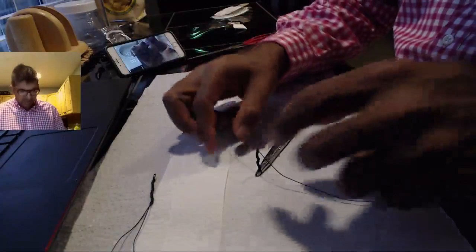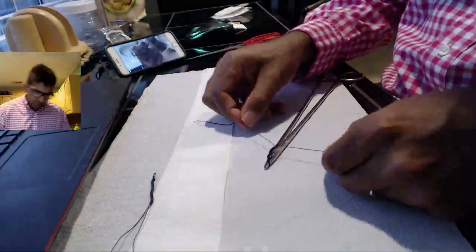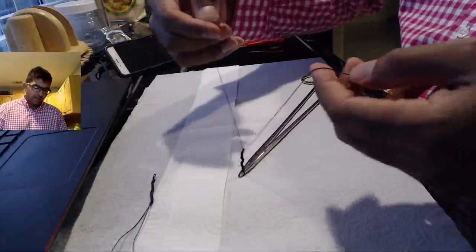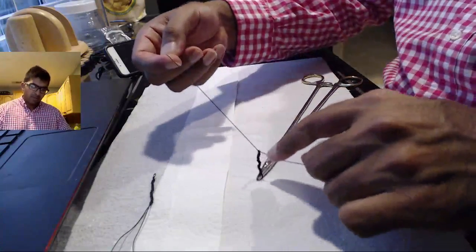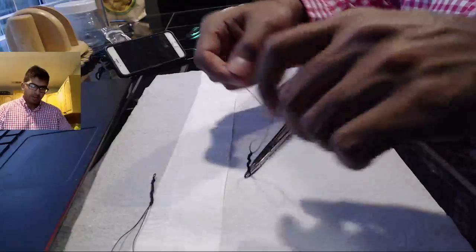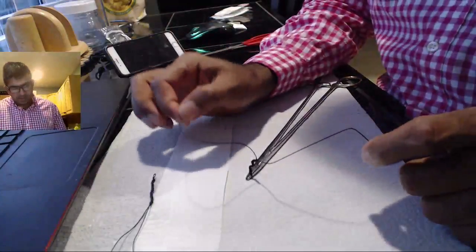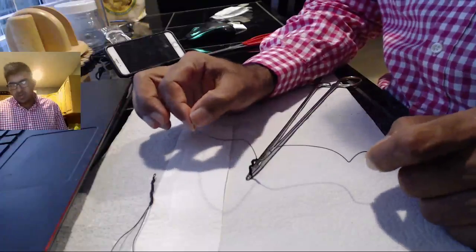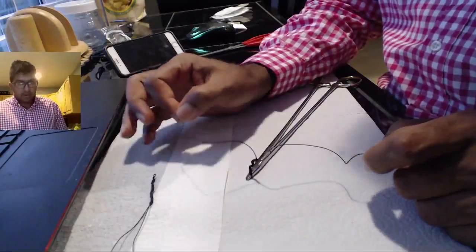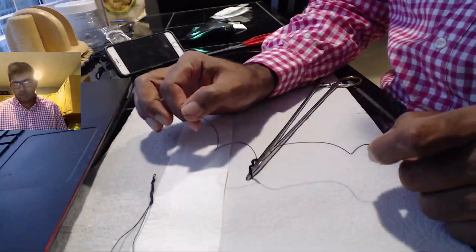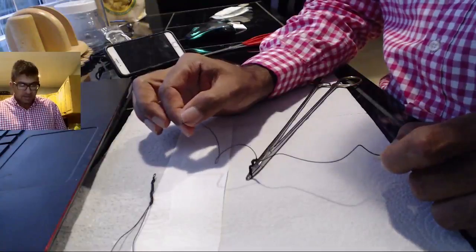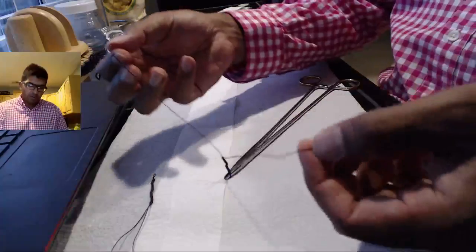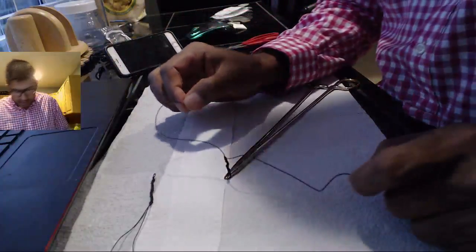So 16 knots in one minute. If you look at the knots, they're very uniform. I alternated from forehand to backhand. And the more important thing is that I brought every knot down and set it down. Forehand, backhand, knot comes down, set it down. And this I think is a very good place to start. I think if you're able to do at least 20 knots in a minute, I think that's a pretty good benchmark. Now as you become further on in your training, I think you should probably shoot for in the mid-20s to 30s. And I think that's pretty good motor memory for at least learning how to tie knots.